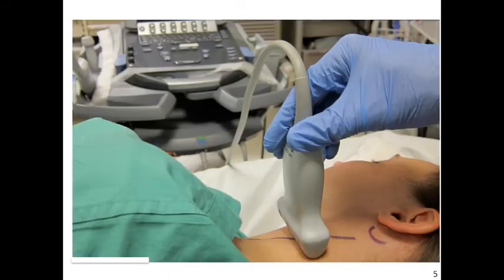Here is the optimal patient positioning to perform this block. The patient is in the decubitus position with the affected side facing up. The posterior border of the sternocleidomastoid is marked in purple marker here. This is a good landmark to place the probe to begin the scan. The probe is placed in the transverse orientation at the level of the mid-neck. The patient can then be scanned superior to inferior and anterior to posterior to identify the anatomy.